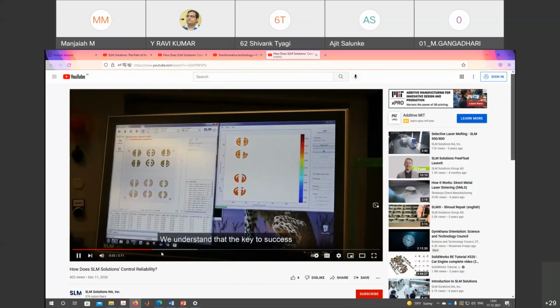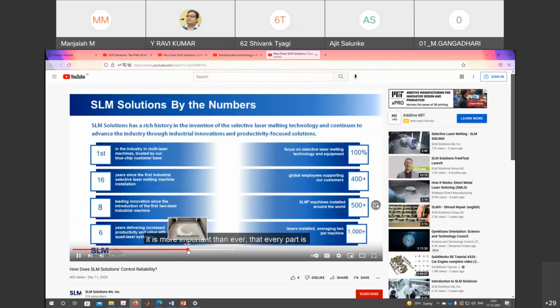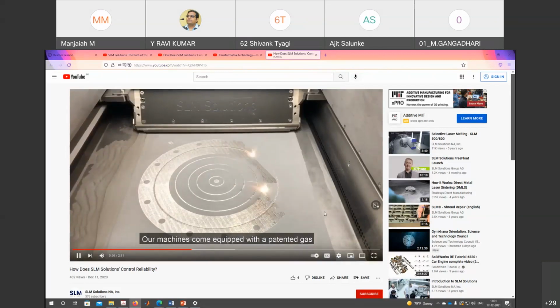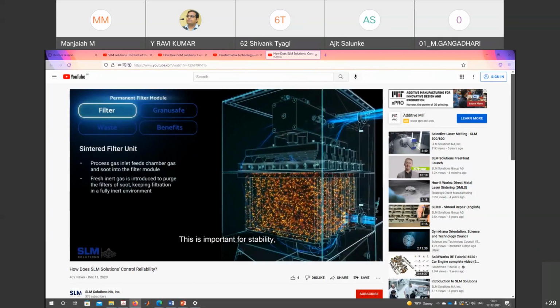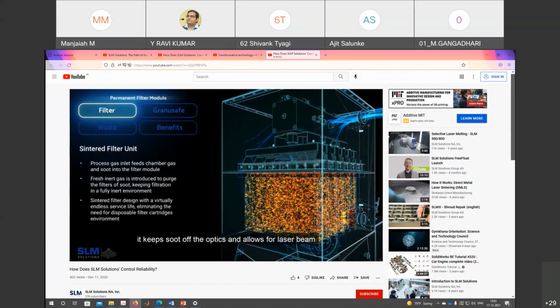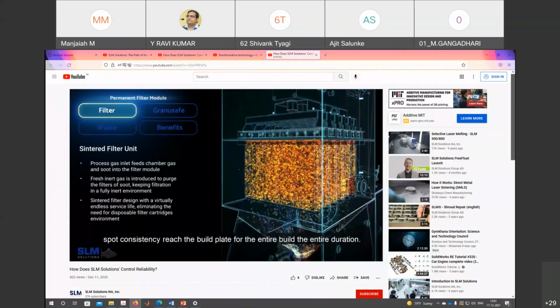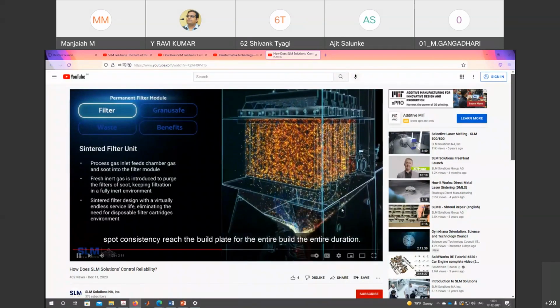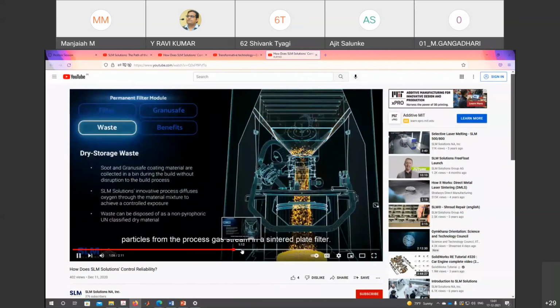These are all the design aspects that can be printed and monitored, including the rate of the fabrication process. You can see how the fabrication takes place in the SLM process, the sintering and melting, the grain structure, how much metal waste there is, and what the benefits and advantages of the SLM process are for medical parts.